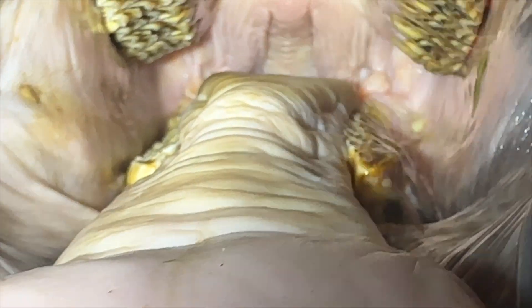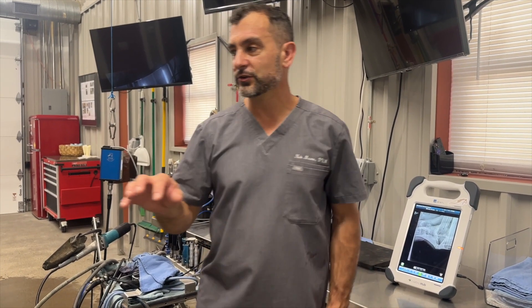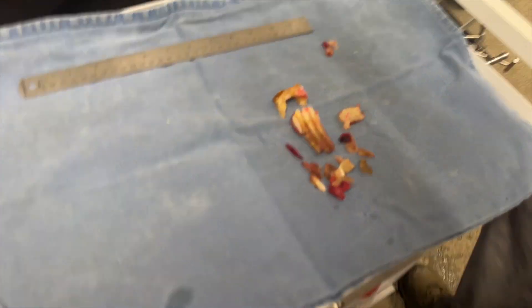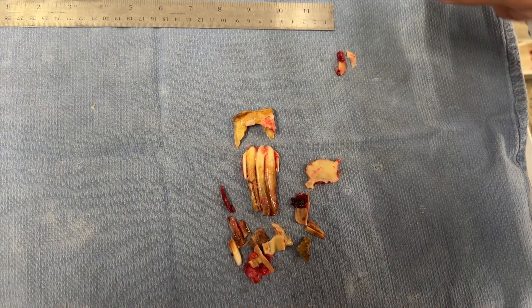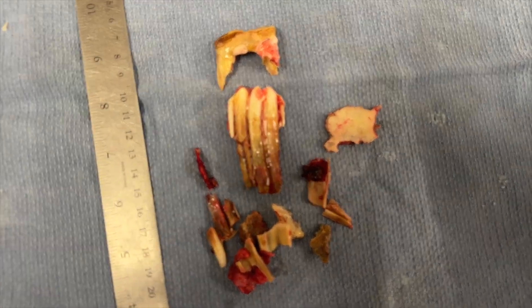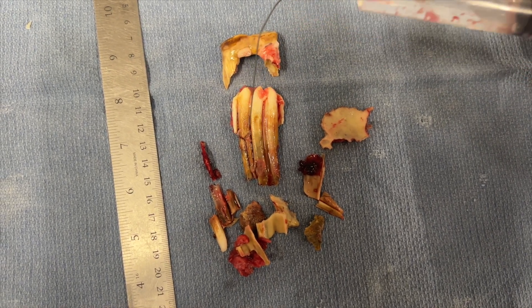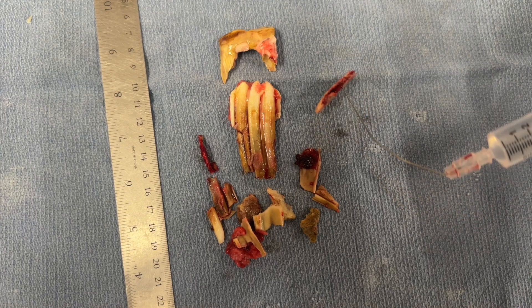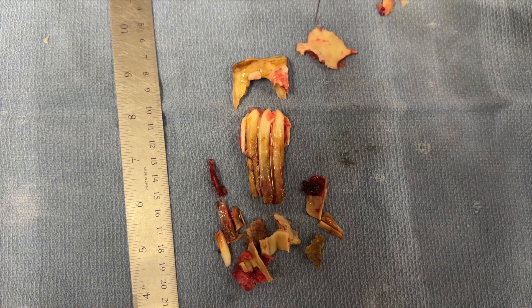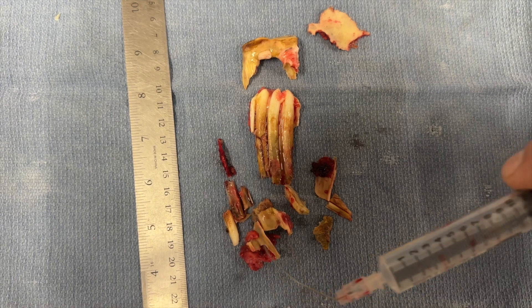Removing the bad tooth is so important for healing. We did the extraction. Here's the tooth: the deciduous baby tooth, and then the tooth that was infected and broken. Here was a dead piece of bone — a bone sequestrum — that we pulled out with our fingers. That's very painful and responsible for a lot of the swelling and pain. And here is all kinds of broken, dead, necrotic tooth.